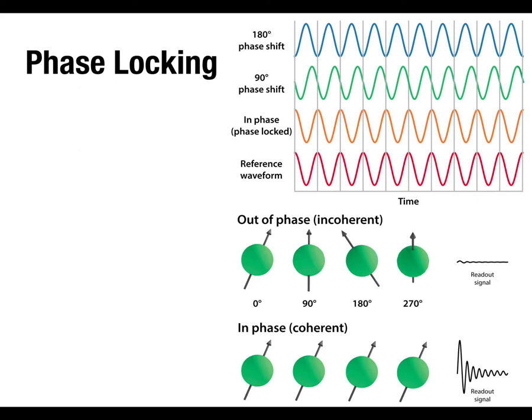we can imagine that the sine wave is just describing where they are in their precessional cycle. Right? So if I start over at the left here with this red one, you can imagine that's at one point in the transverse plane, and then as it's turning, it's just doing that. And when it gets back up to a peak, so it goes down and then back up, that would be the same point within the circle. Each peak would be the same point in the circle.